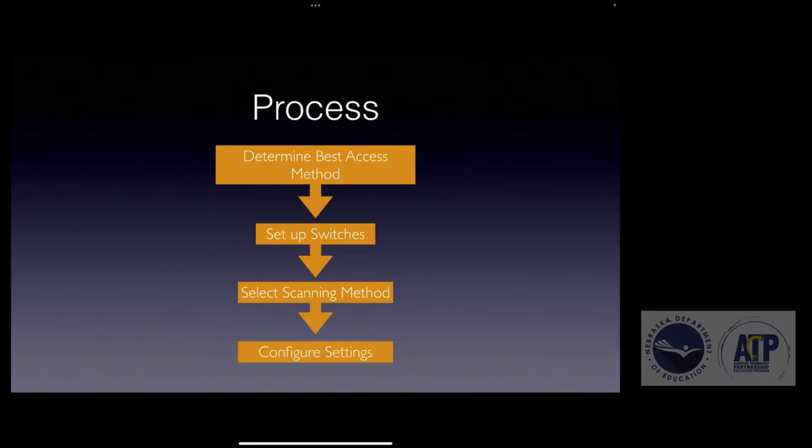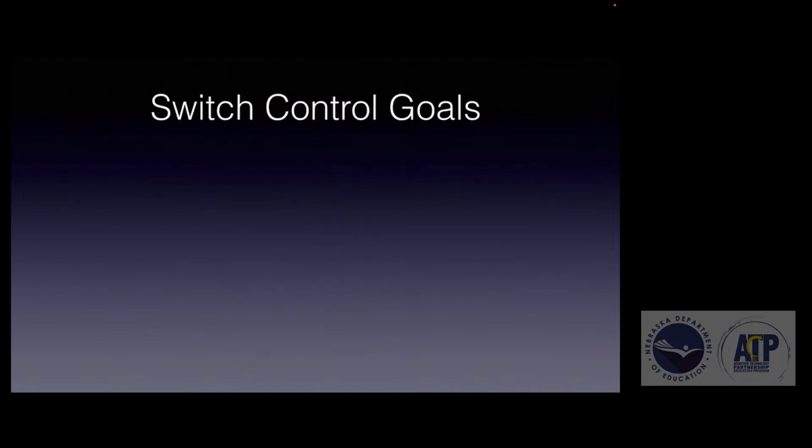And then you're going to configure the settings. There's a lot of configurability within the iPad that you'll be able to set up. And we won't cover that in this basic course, but for those next steps, there's a lot of configuration and a lot of control that you're going to have when you set up switch control.